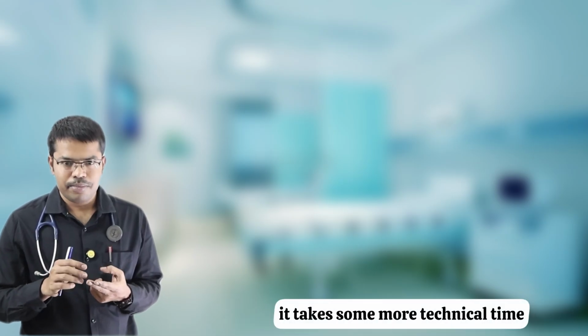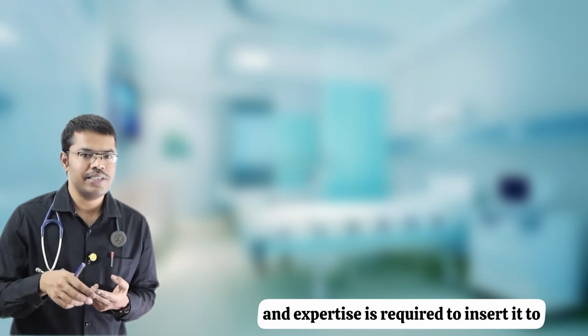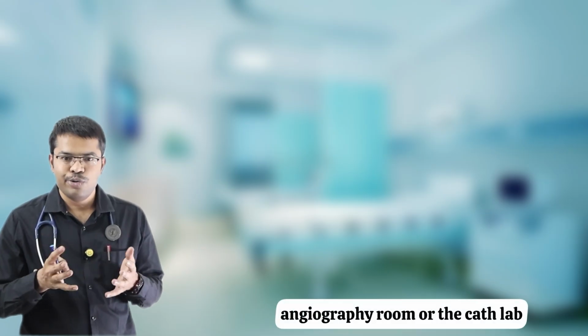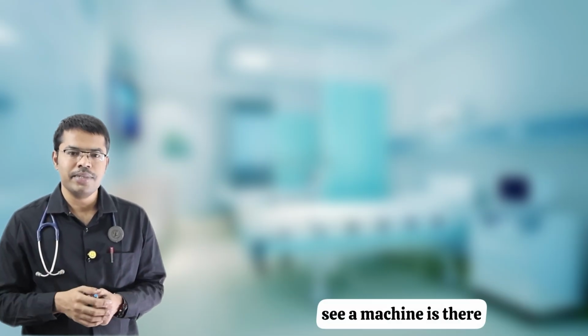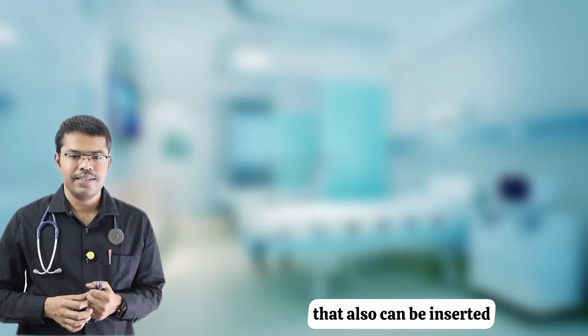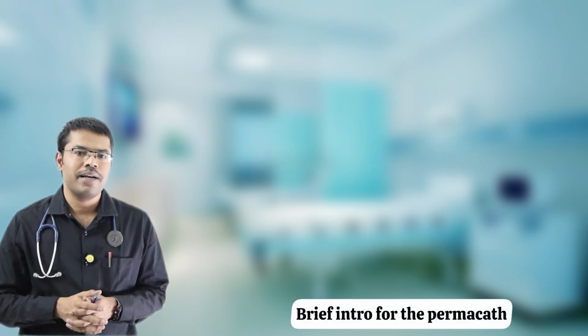It takes some more technical time, and expertise is required to insert it and make the tunnel. Probably an angiography room or the cath lab, a place where a C-arm machine is there, might be required. Without that it can also be inserted, but there is a risk. The size is big, the length is bigger. This is the brief intro for the Permacath.